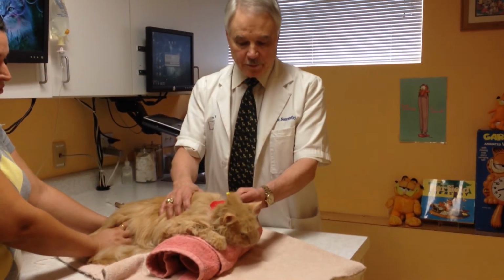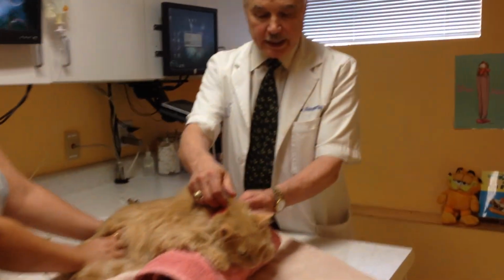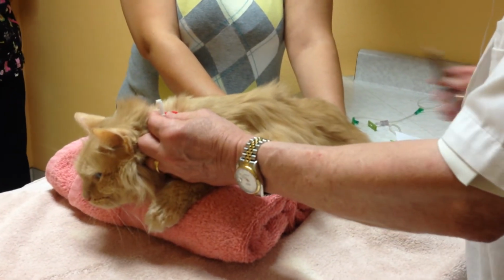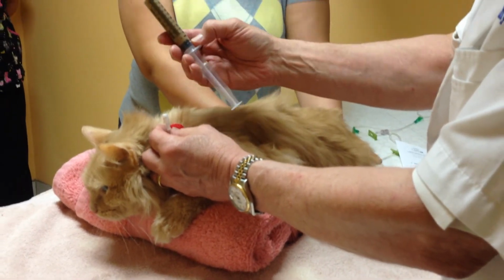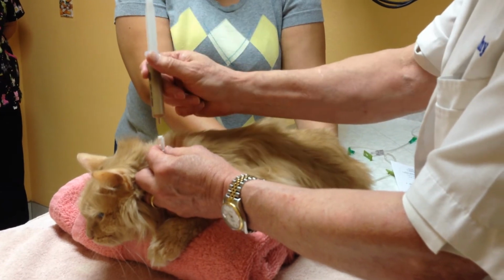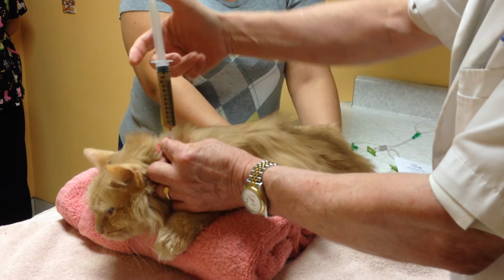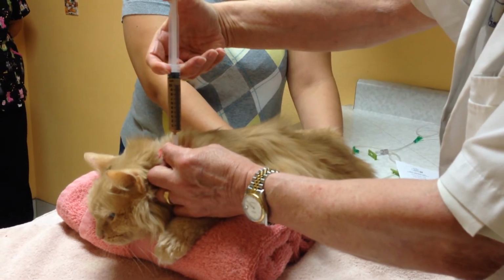The first step in the feeding process is to take the cap off. And this cap simply unscrews. We have food in a syringe. This is a 12 cc syringe. You put the syringe directly onto the feeding tube and you inject it.